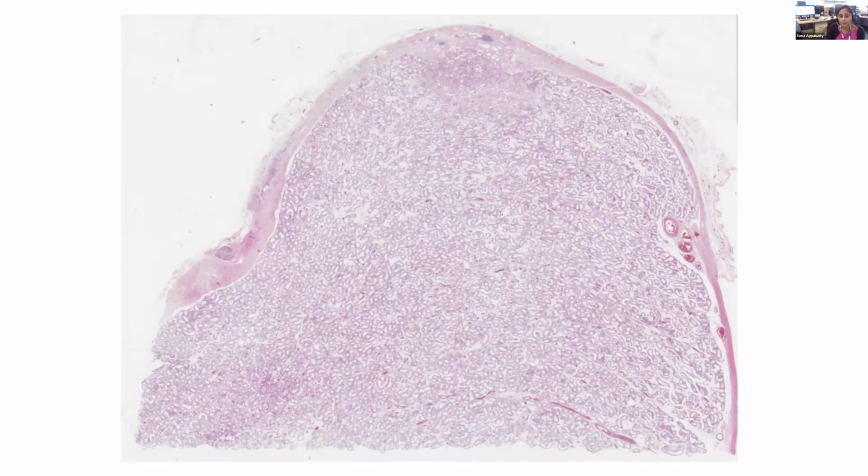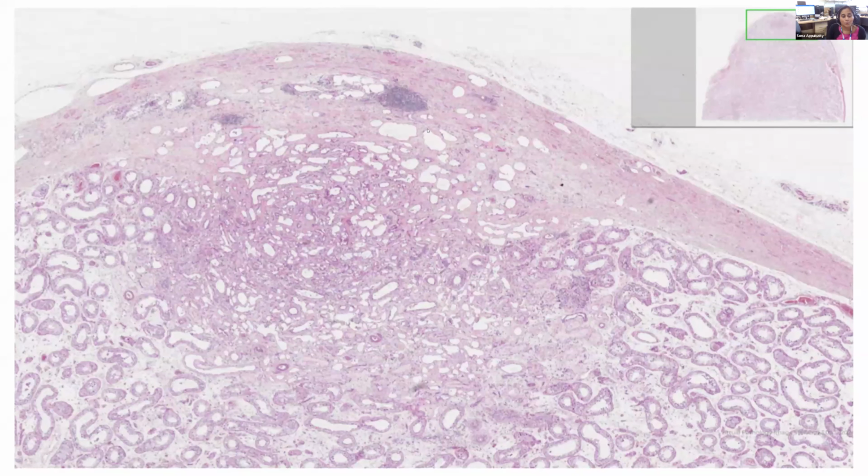If you look, it's a lot of spaces, more like atrophic change. Even among the lumen, it looks clearer, like basal and adluminal, with some adluminal missing or something. And then we have something happening here. We'll go on higher power. Don't worry, we're not just sitting there at low power. So we have the main lesion, which is not circumscribed, of course.